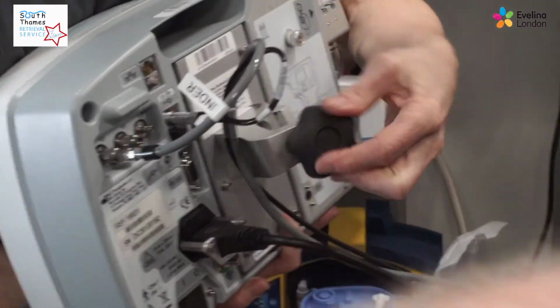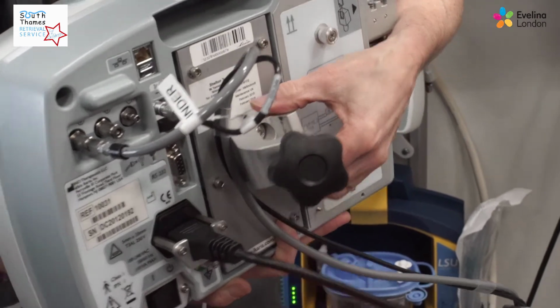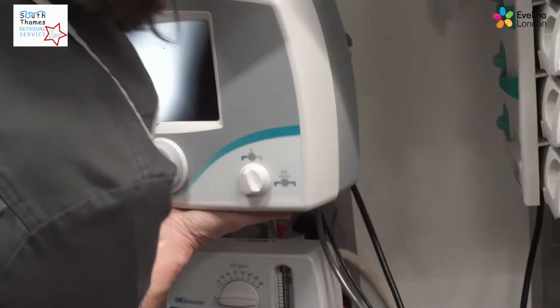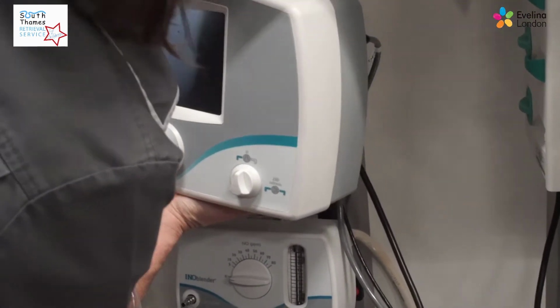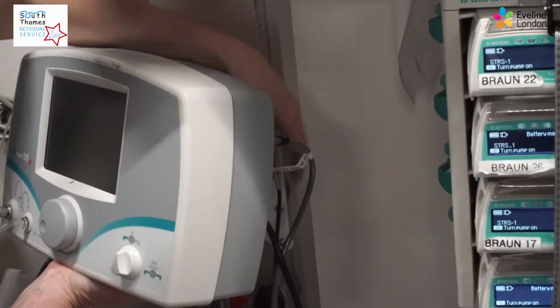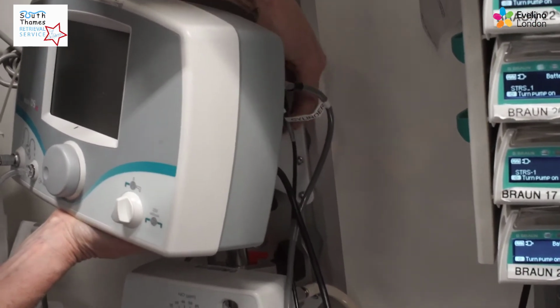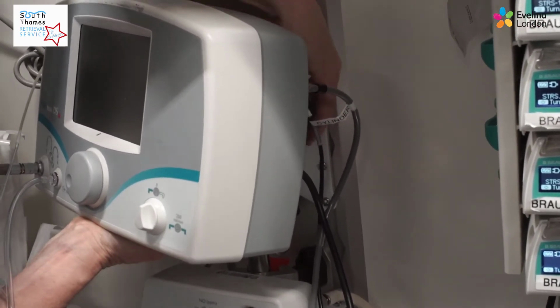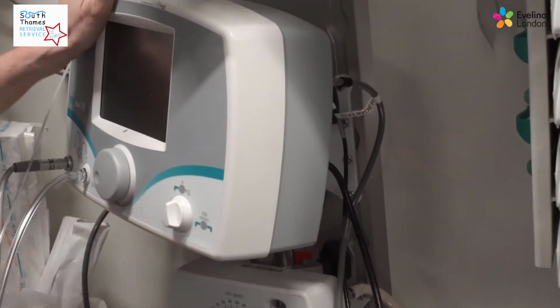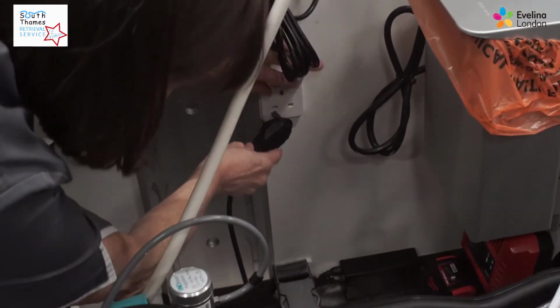And to do this, you need to have this open as much as you can, and sometimes it does catch on the back of the clamp. Put it on, you just have to screw it. If you twist it slightly towards you and tilt it up, it goes in much better. So the secret is tilting and holding it towards you. Now I want to just put the plug for the nitric in here so it's charging.